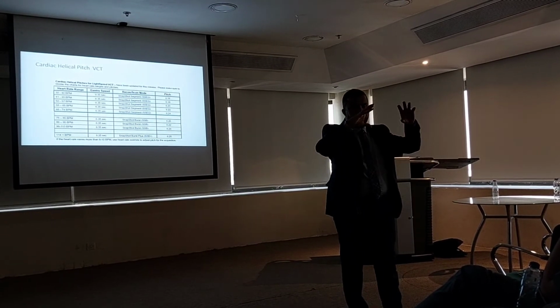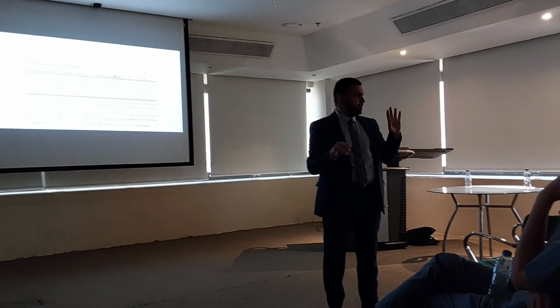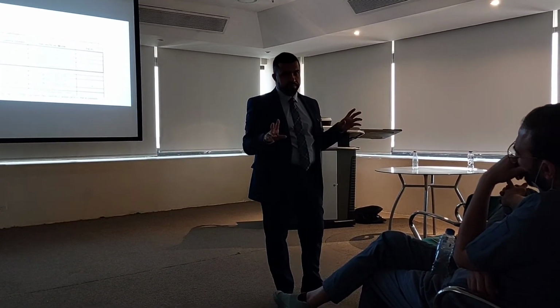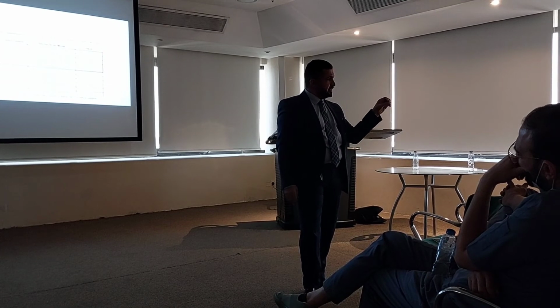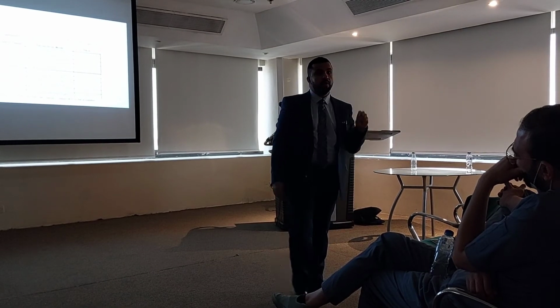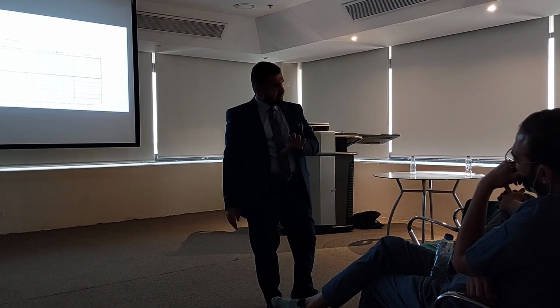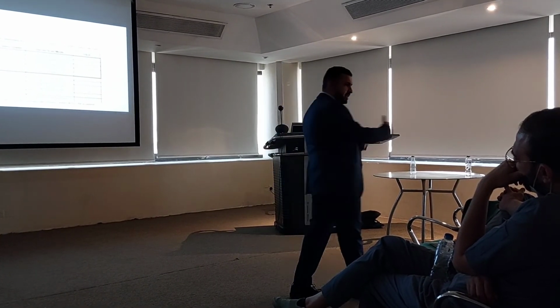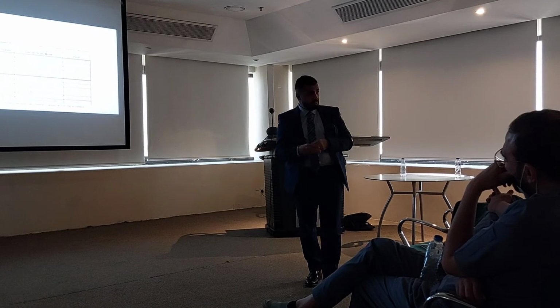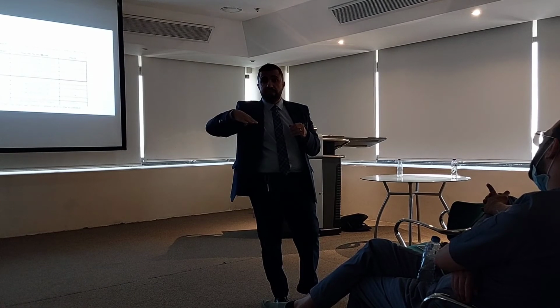I prepare the procedure and protocol, all are done, contrast is ready, I did smart prep, I did timing bolus, all are done. Now I'm in a position. I will confirm. The patient heart rate is, let's say, 78. Now, the patient is breathing. The patient heart rate is 70 when he holds his breath. I know, because I did this in the start, in the practice before, and with the calcium scoring as well.